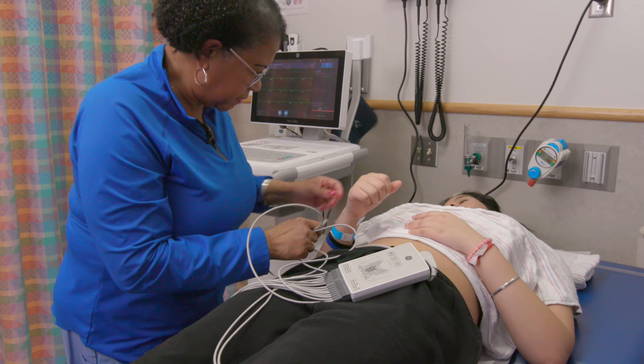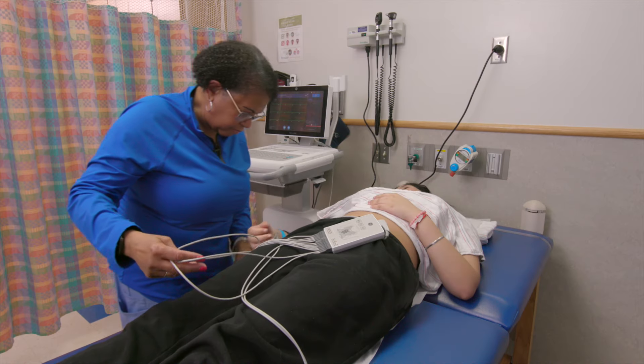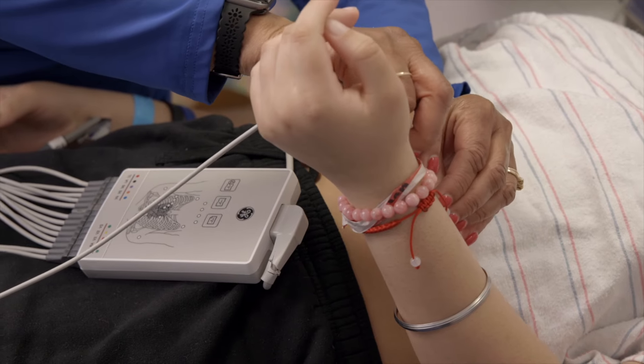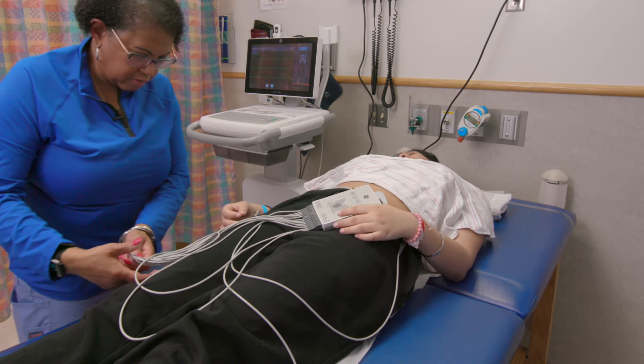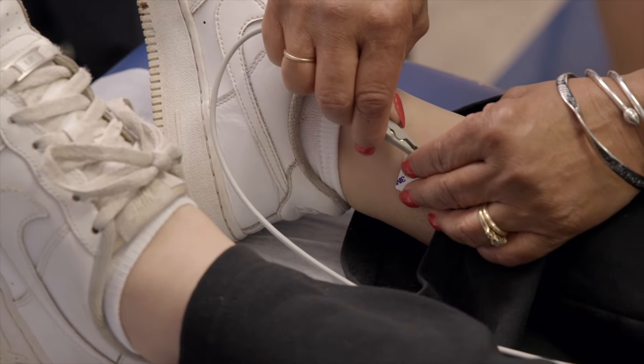This is the right arm, okay? And this is where you're left. And relax your arms down by your stomach. And this is your right leg.